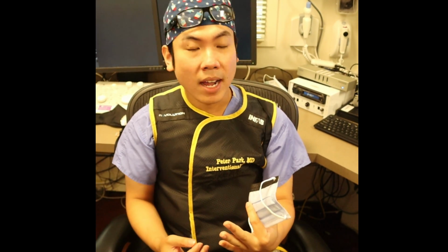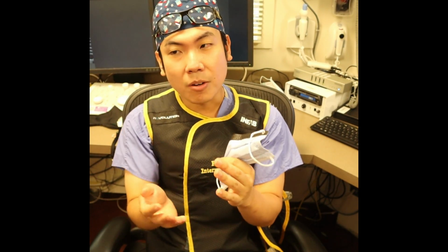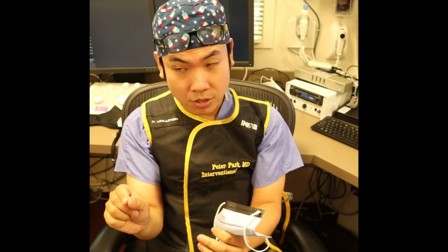If something happens during the case, let's say you lose air out of the stomach, you tend to lose the wire access into the stomach pretty quickly after all the air gets deflated. At that point, you cannot really go back into the same hole that you created, which now is a gastric perforation and becomes a surgical consult.